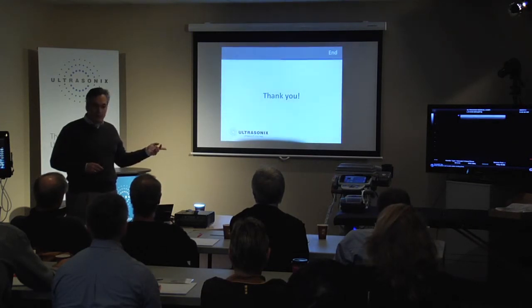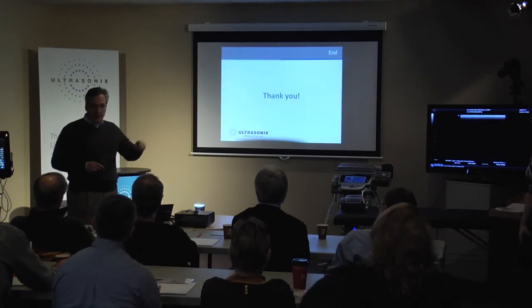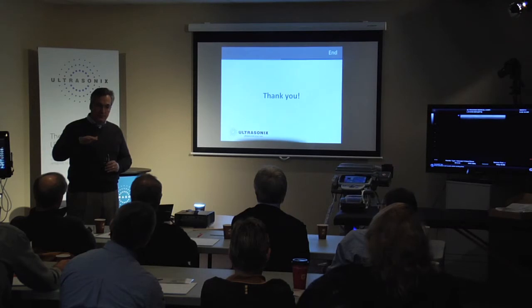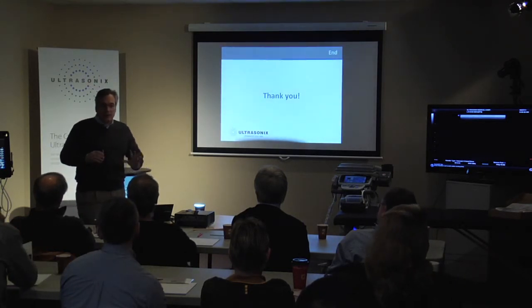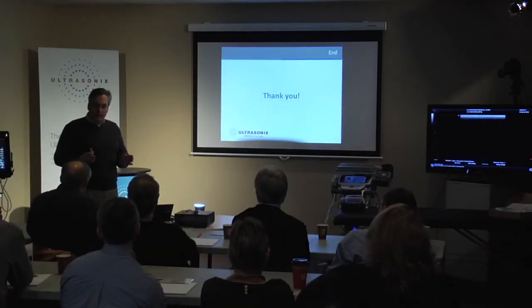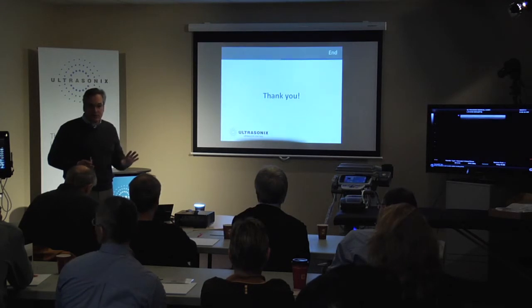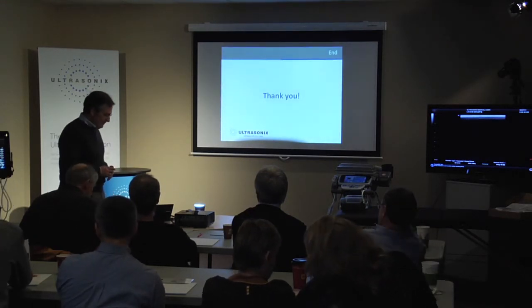The default choice. There is a default. So when you go into Q and you go into nerve block, you're going to get 3 choices: shallow, deep, and general. Whether your nerve choice is shallow or deep, you choose the appropriate one, and then the system will set up a default choice and the overall parameters. We spent hundreds of hours scanning, so we're trying to make this more streamlined and easy. Choose it. It's already pre-auto-optimized if you so choose. Good question, though.